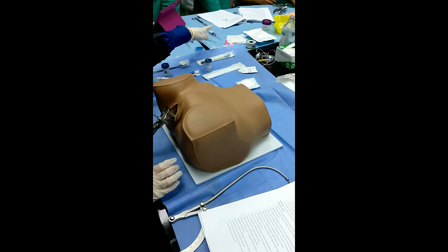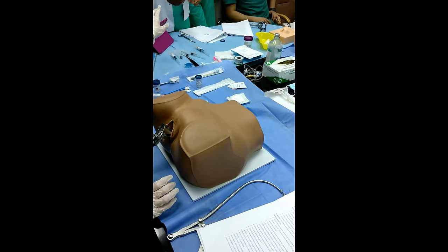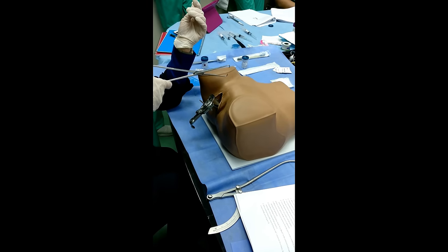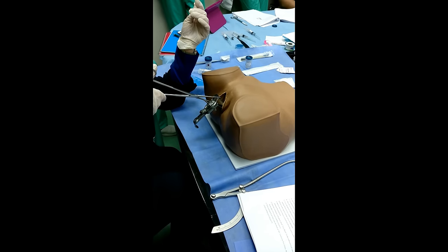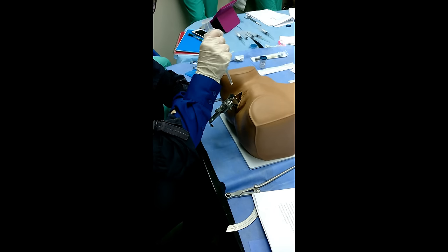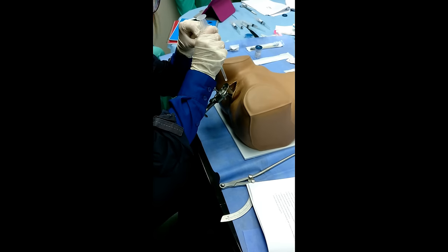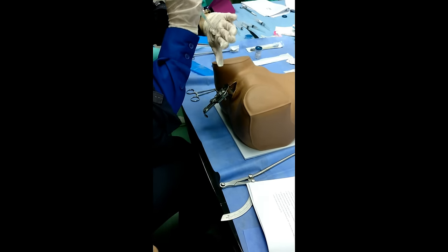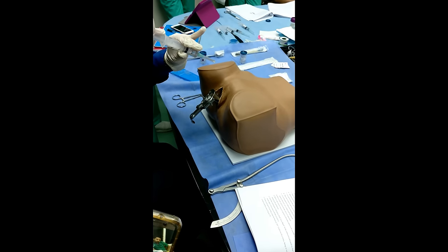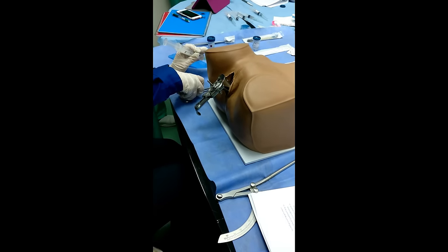This is the tenaculum that is used to fix the cervix. Usually you fix it at 12 o'clock. After speculum insertion, we fix the cervix. It's very painful. That's why the first injection usually is at 12 o'clock, directly perpendicularly into the cervix, to anesthetize the place where you will apply the tenaculum. You introduce the needle and retract to see if we are not in a vessel. After that, we administer lidocaine and we fix the cervix.